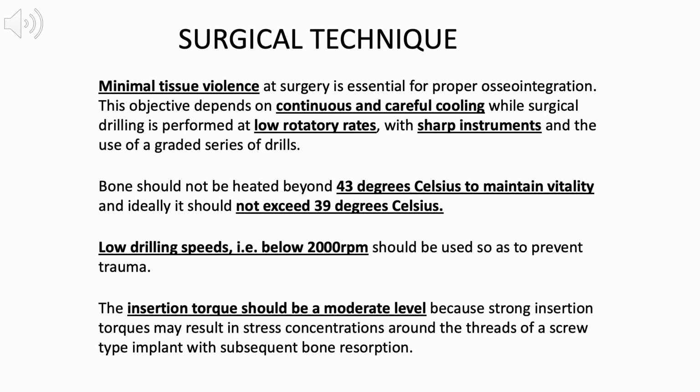Surgical technique. Minimal tissue violence at surgery is essential for proper osseointegration. This objective depends on continuous and careful cooling while surgical drilling is performed at low rotatory rates, with sharp instruments and the use of a graded series of drills.